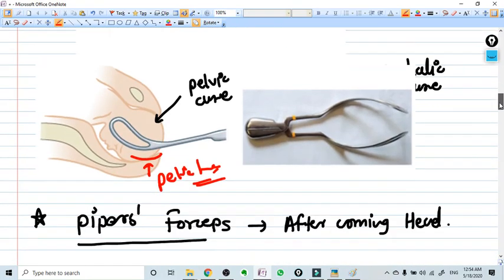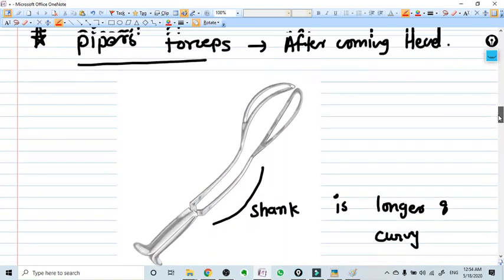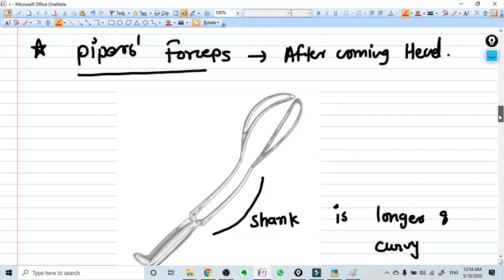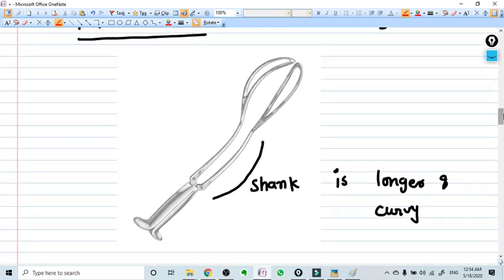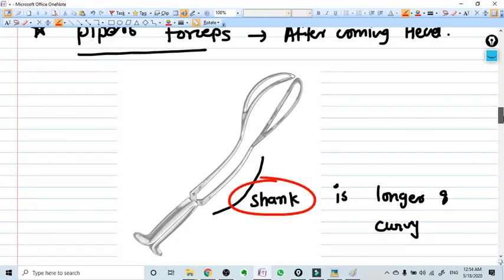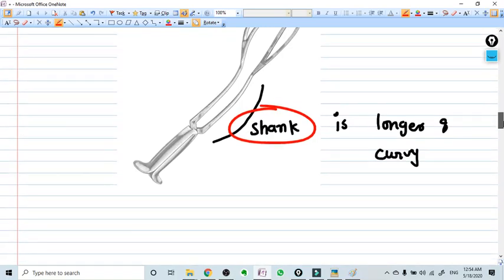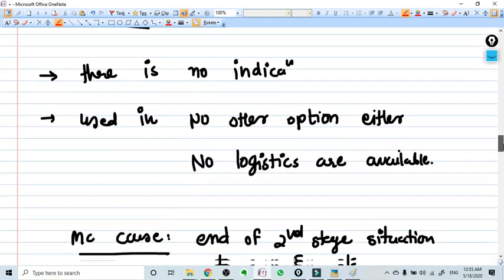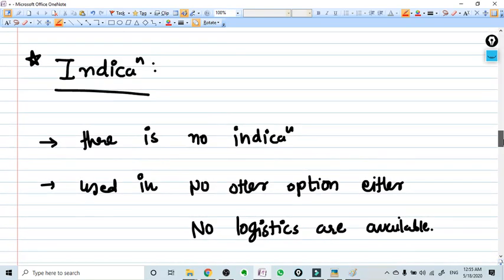Another forceps hardly used sometime is Piper's forceps. They are used for after-coming head of the breech delivery. And you remember why? Because the shank in this forceps is longer than the Wrigley's forceps. That's the only information you need to know about the forceps.